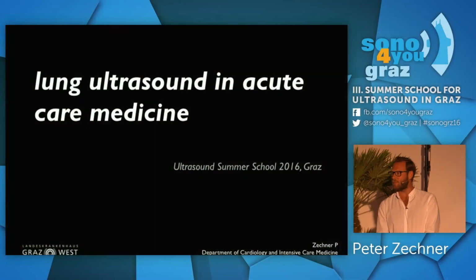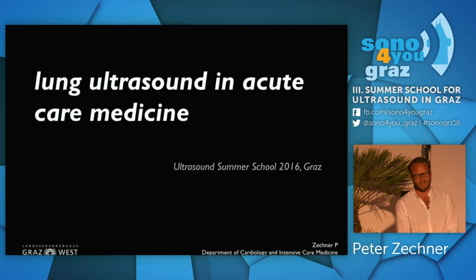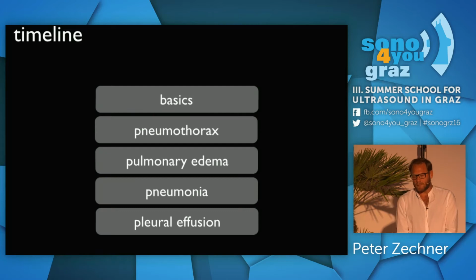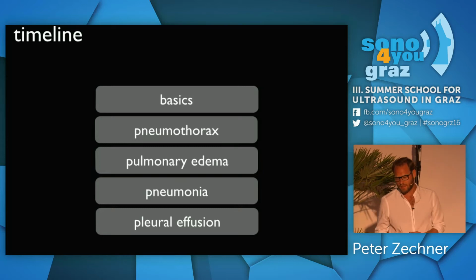So for the next 45 minutes, I'm going to spend on a topic called lung ultrasound in acute care medicine. Later on, I will also spend some slides on the diagnostic workup of DVT with two-point compression sonography. My timeline for the first presentation is as follows.